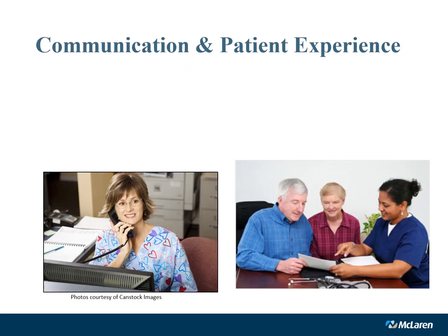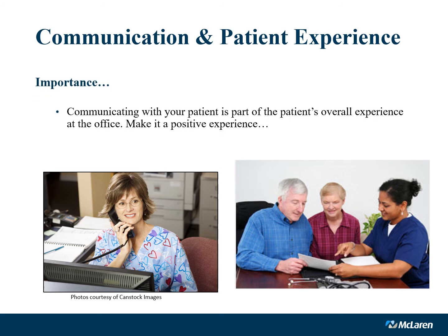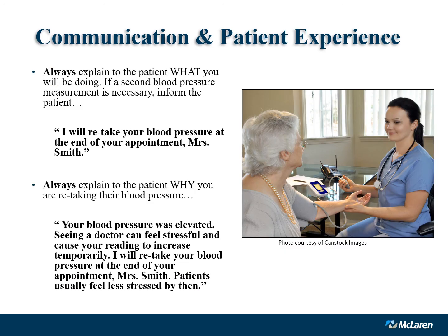Let's now touch on communication and patient experience and the importance of that. Communicating with your patient is a part of a patient's overall experience at the office, so let's make it a positive experience. Always explain what you will do and why you will do it. Again, always explain to the patient what you will be doing. If a second blood pressure measurement is necessary, you could inform the patient with this example. I will retake your blood pressure at the end of your appointment, Mrs. Smith. And again, we should always explain to the patient why you are retaking their blood pressure.